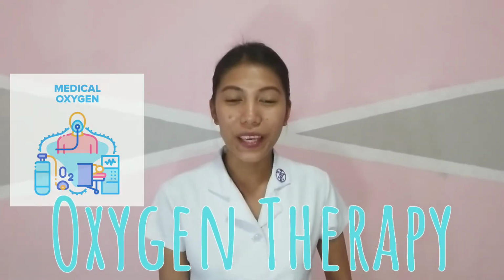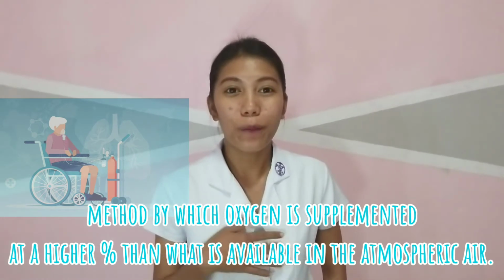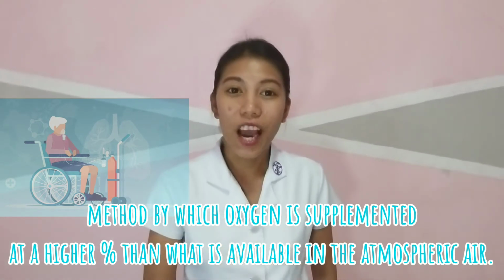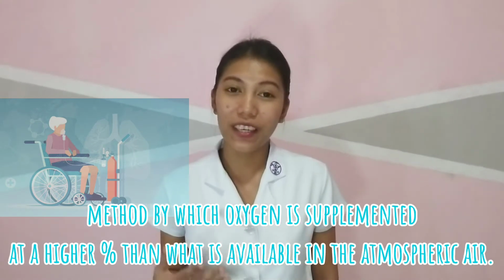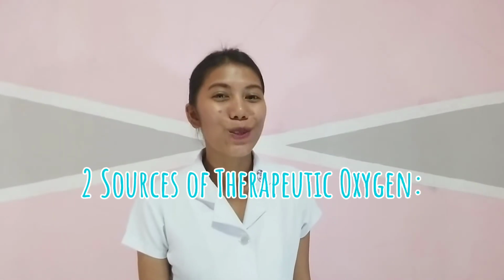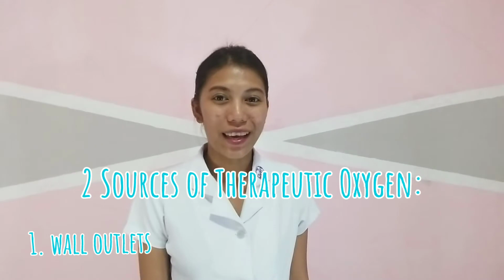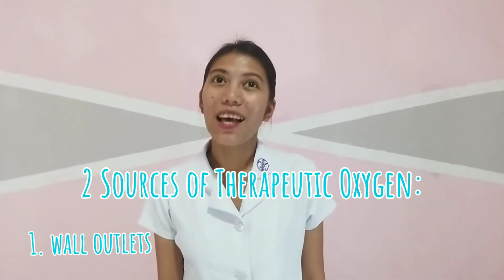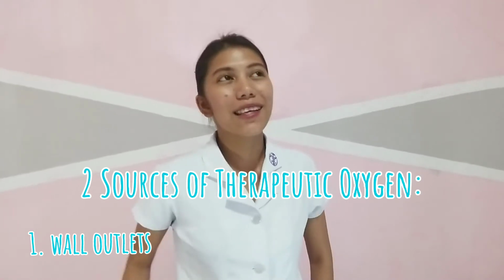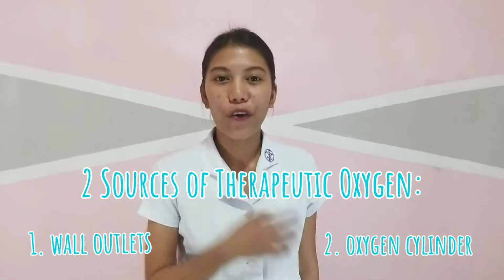So today I am going to perform oxygen therapy, and this method is used for oxygen supplementation at higher percentages than what is available in the atmospheric air. There are two sources of therapeutic oxygen. We have the wall outlet, which we can usually find in Davao Doctors Hospital, and lastly the common one, which is the oxygen tank or cylinder.